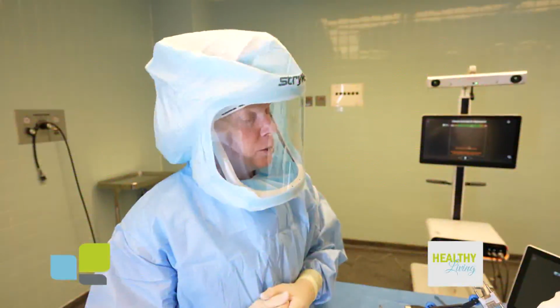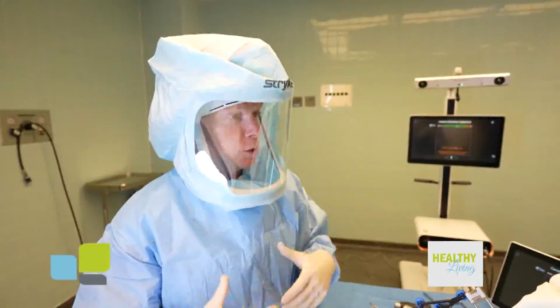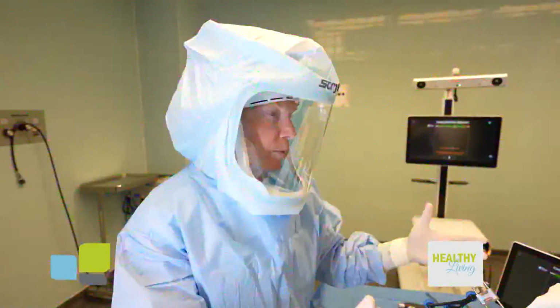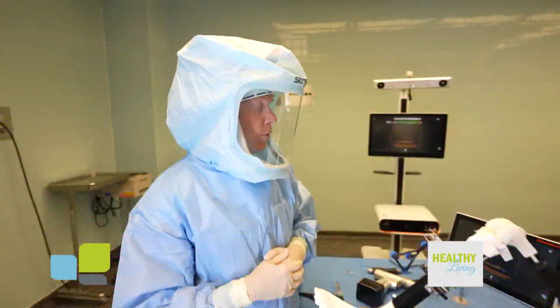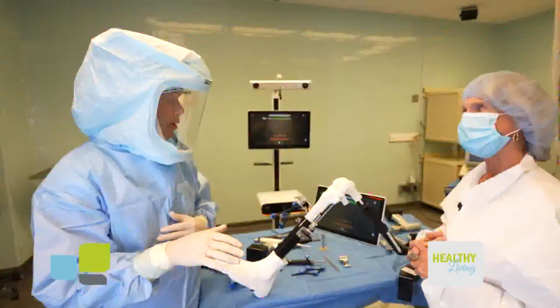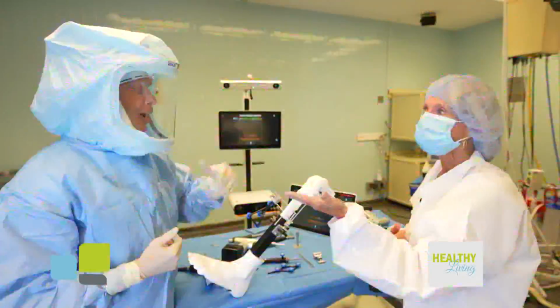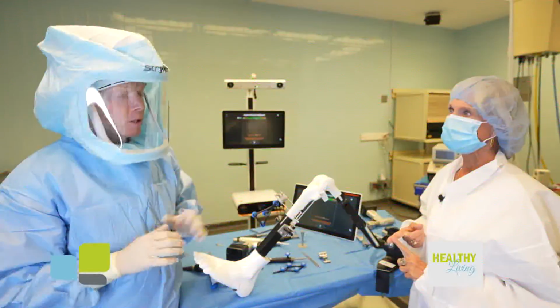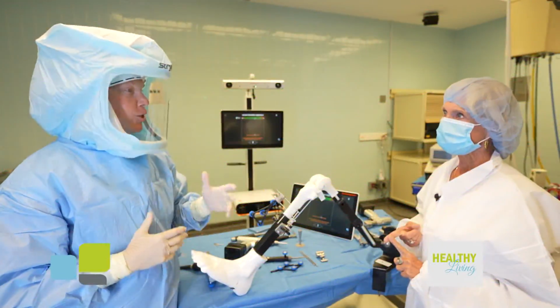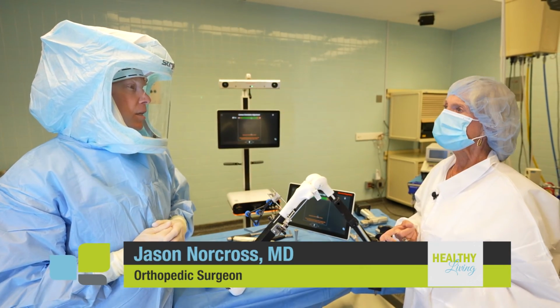And in the future, we'll be using it for all of our revision knee replacements. Oh, wow. Down the road, when a knee fails, we can actually use it to precisely redo the operation. So it will be the workhorse of knee replacement surgery going forward. So I use it on everybody now. And that doesn't necessarily mean when you come see me, you're going to have a robot knee. Exactly. That's not how that goes. In fact, we really work on trying to manage your arthritic pain in your knee with non-surgical means until it doesn't work.